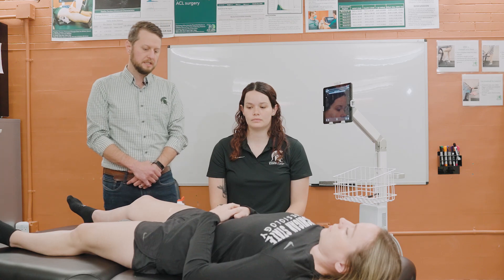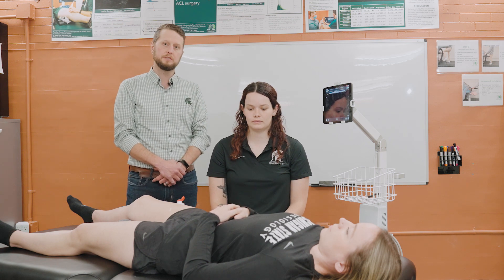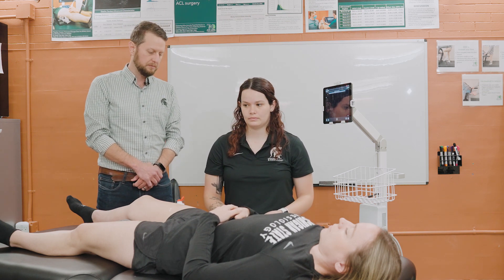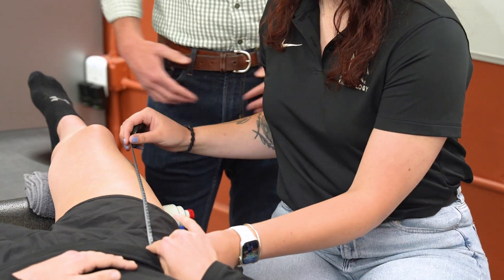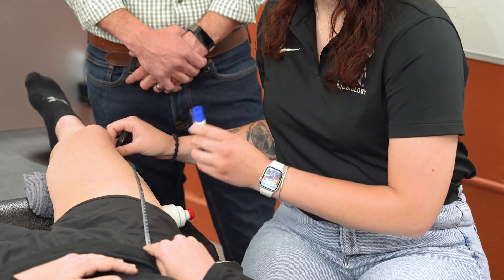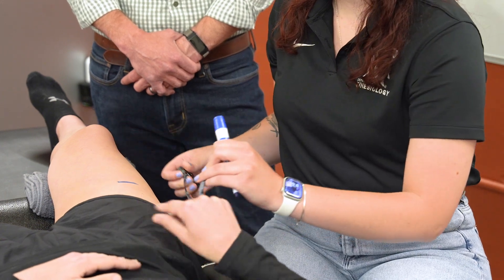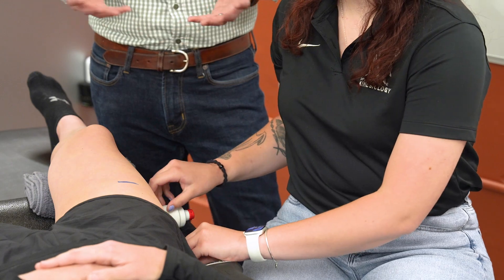To do this technique, we're first going to measure the individual's leg length. Jess here is going to demonstrate how we do this by measuring the distance between the ASIS and the lateral joint line at the knee. Once we find this measure, we'll make a mark at 50% of that leg length as a way to standardize where we're putting this probe and where on the muscle we're assessing every time.